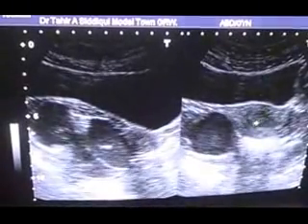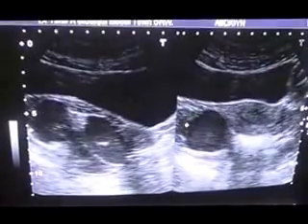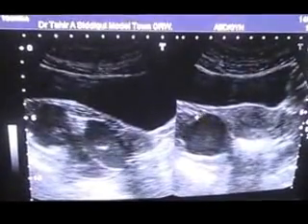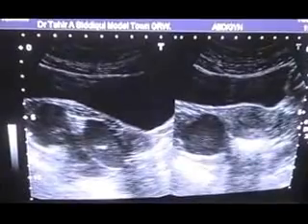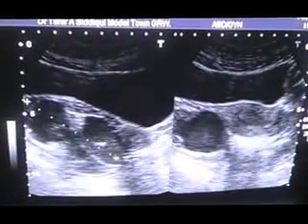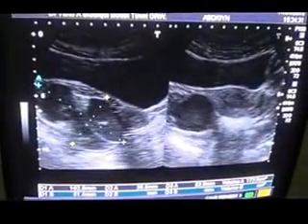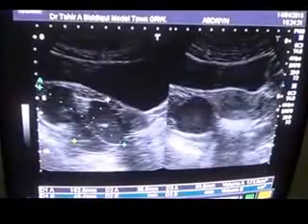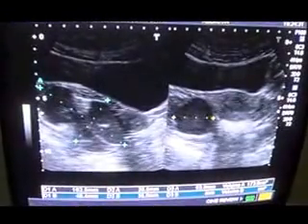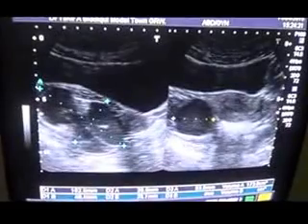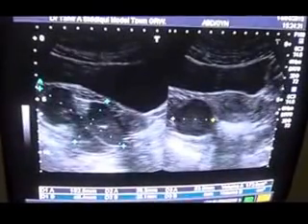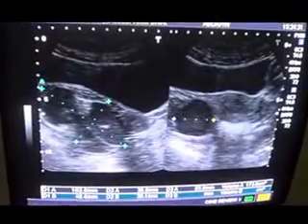Here is the transverse section. Now this is the uterus, this is the endometrial canal, and this is the transverse section of the cystic area with strong back wall, filled with debris. Let's see what is the approximate volume of this cystic area. The approximate volume of the debris within it is approximately 173 ml.